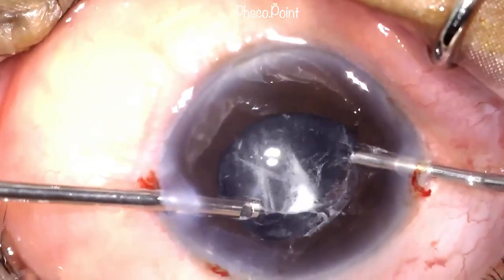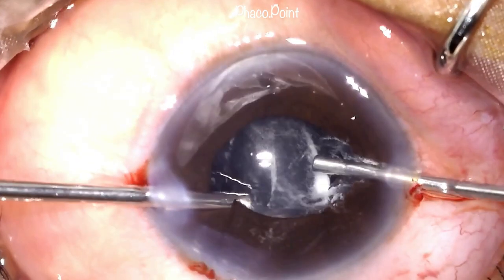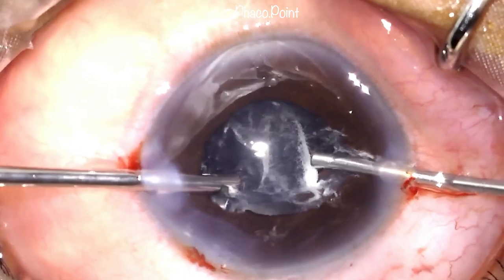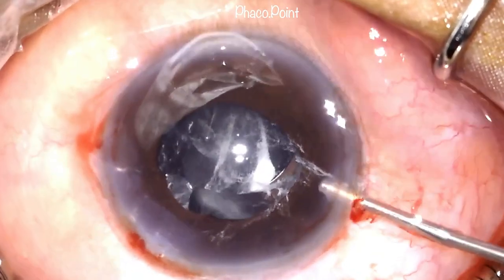Whilst performing the anterior vitrectomy, note how I accidentally catch the iris, which results in a little bit of a sphincterectomy. The only problem that this is going to cause is a cosmetically not so round pupil. At the point where we've caught onto the iris, you would have a tiny notch in the pupil, which you will see towards the end of the surgery.